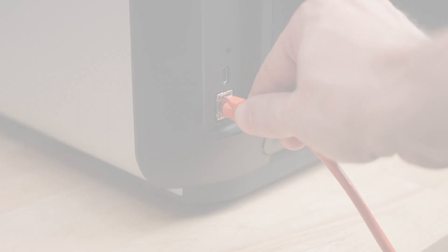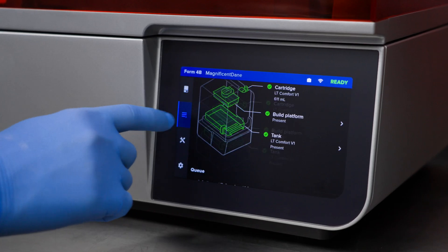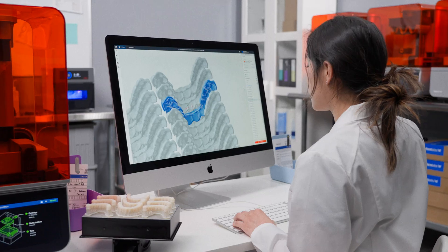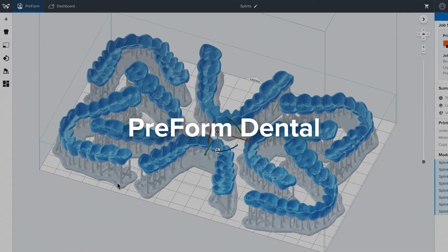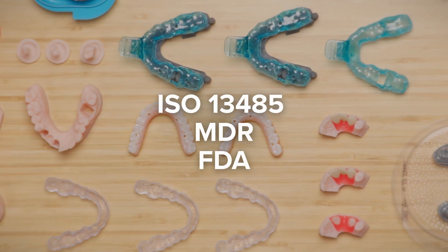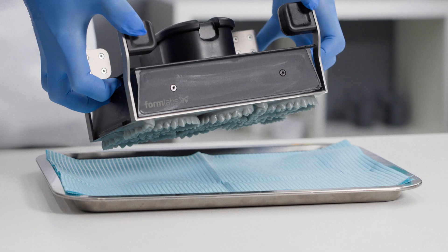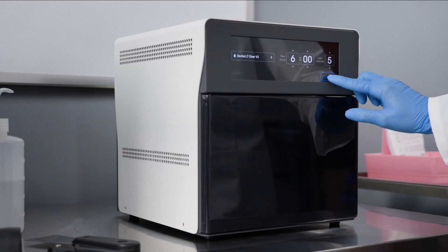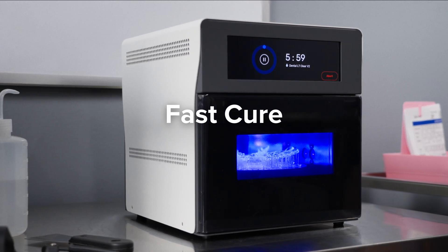Finally, with Wi-Fi, Ethernet, USB, an optional camera, and a large intuitive touchscreen, it's easier than ever to control your printer from nearby or far away. All of this is designed and validated to work seamlessly with our powerful, easy-to-use dental software, industry-leading materials for any application, and automated post-processing tools for a workflow so easy that anyone can start printing in 15 minutes.